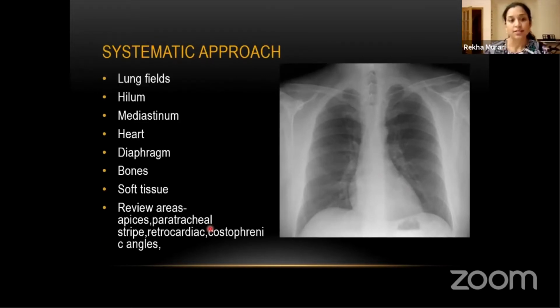So this is the systematic approach. The order of it doesn't really matter. Some people use a different order, but the most important thing is you adopt a system and you look at it in a certain order and you continue to do it over and over, the same thing. So it becomes like second nature, and in that way you do not miss any pathology and you do not miss any subtle abnormalities on the X-ray.